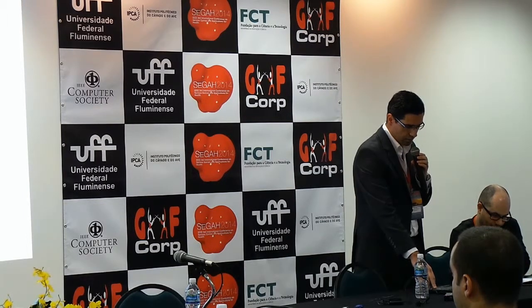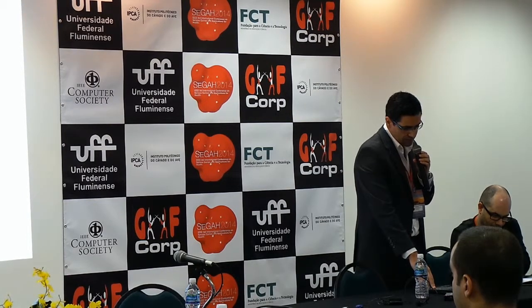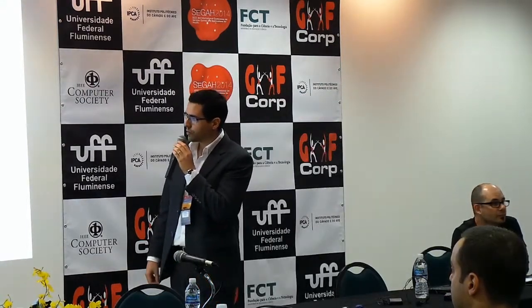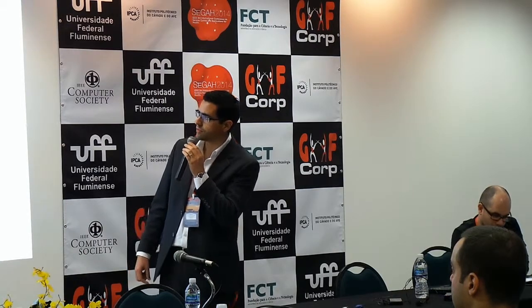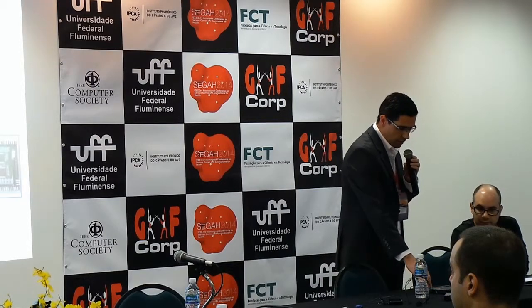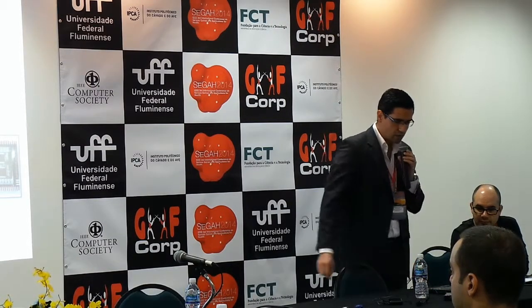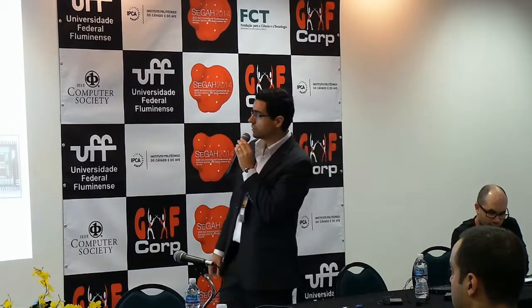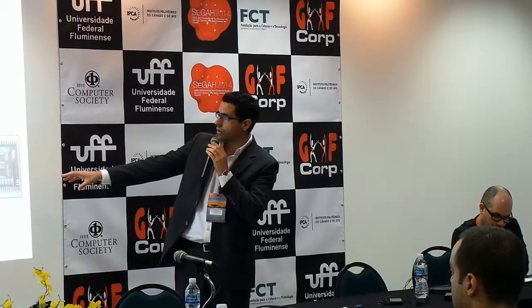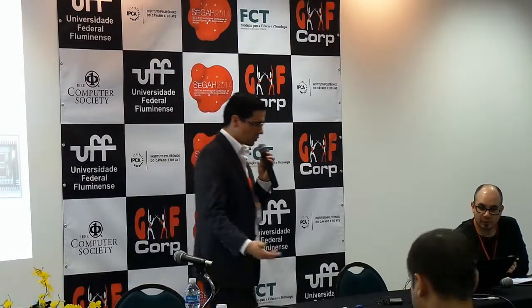So, going back to our EEG system, this was the first prototype. This was a bulky one, as you can see. It was stabilized in an acrylic cap. It had very large dimensions, a little bit heavy. Then we built the new one. It's already complete. It is a 65 by 68.5 millimeter system. It is much more miniaturized than the first one. It is already being embedded in a cap like this one.